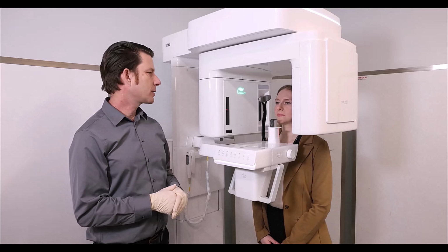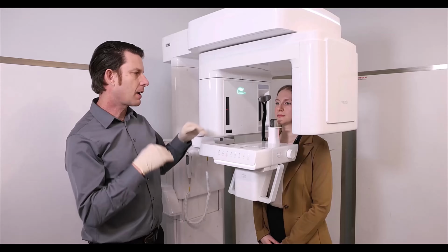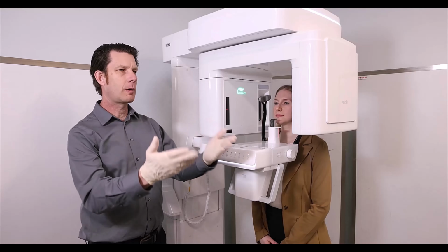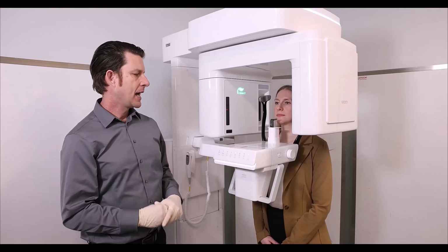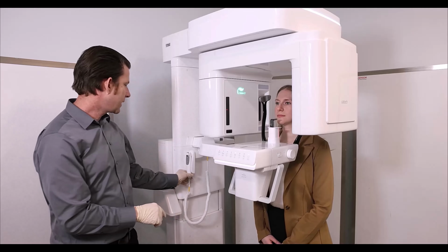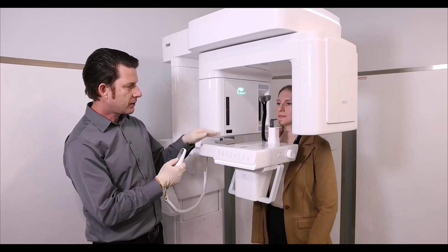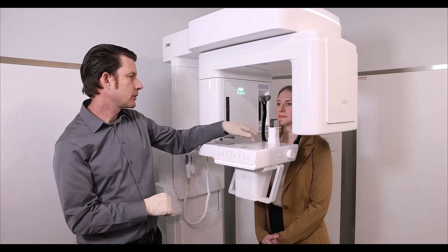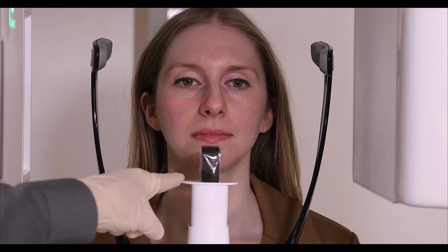What I'm looking for is to make sure that their chin rest is just below the chin. So ideally I want to have them kind of looking out at the horizon in a natural head position. And I'm going to go on the chin rest here, column up or down, or I can use the hand switch here to raise or lower this chin rest. So I'm going to have the chin rest just below the patient's chin.